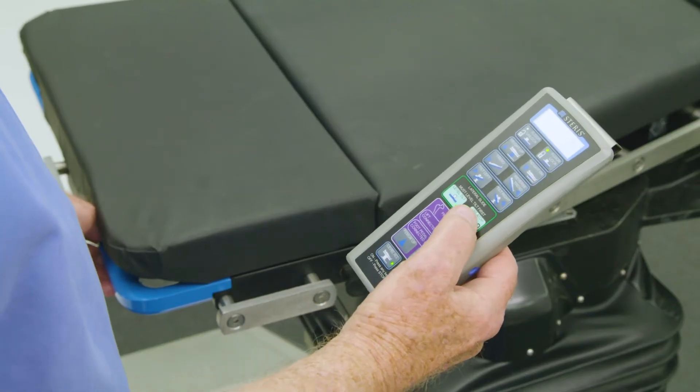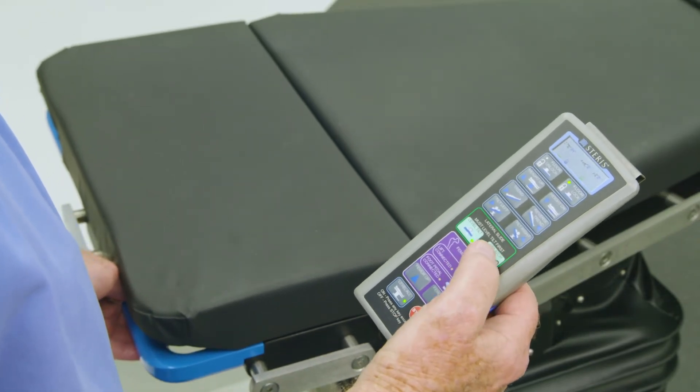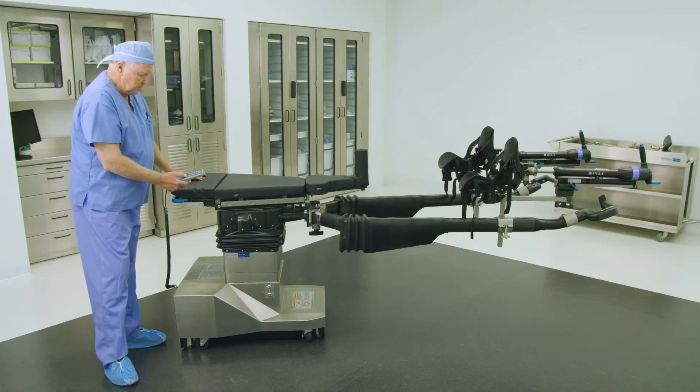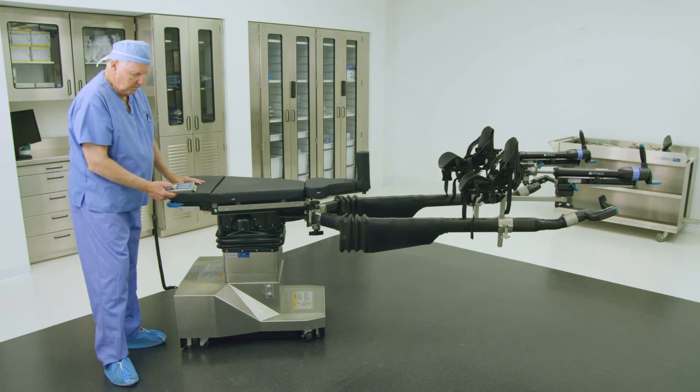Alternatively, the tabletop can be translated by unlatching the lateral slide through the buttons on the primary hand control. Press and hold the green unlatch button on the hand control, and then physically push the tabletop laterally left or right until it locks in position.